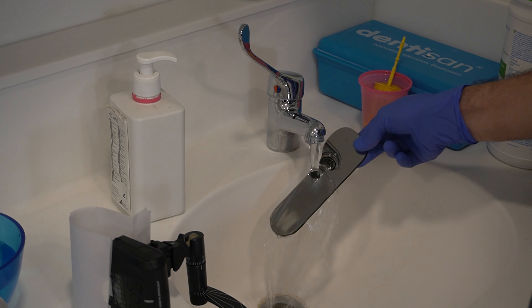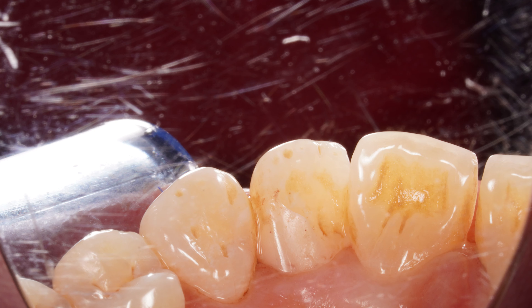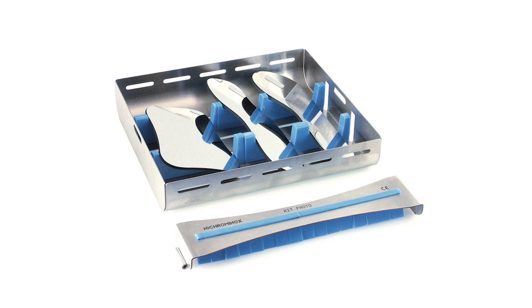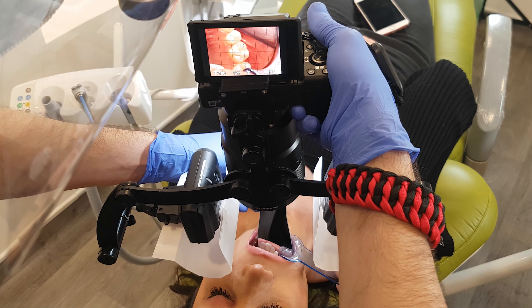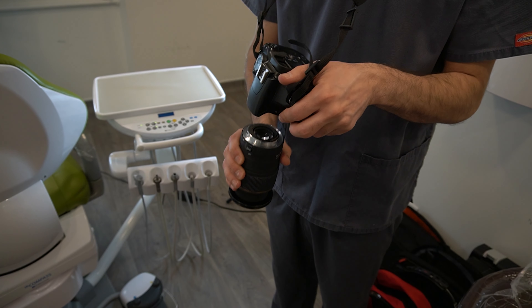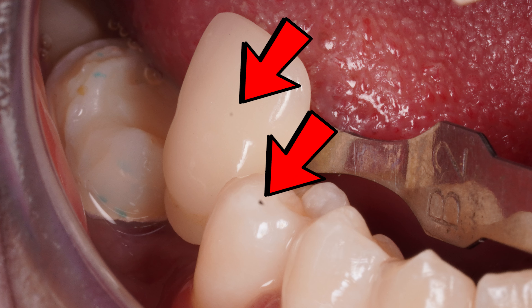To make your mirrors last, take good care of them. Never wipe them with a paper towel as it's abrasive and will scratch the surface. If you warm them up with warm water, dry them with a three-in-one spray or a microfiber cloth. Don't stack mirrors on top of each other or put other instruments on top of them. The best way to clean them is cold sterilization or autoclave. There are also a couple of camera accessories worth buying: a reliable camera strap in case you drop the camera, and a blower to clean dust off the sensor. When changing the lens, hold the camera upside down to prevent dust getting onto the sensor — dust causes little black spots in your photos consistently.